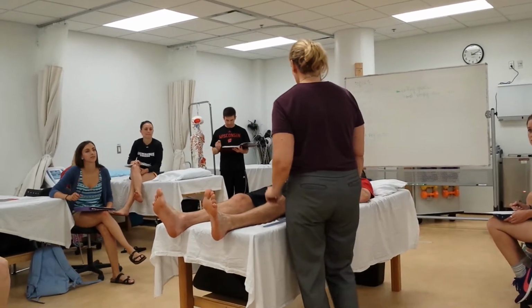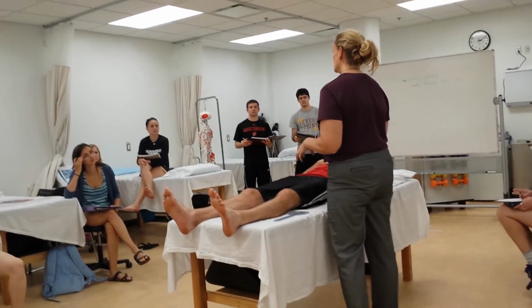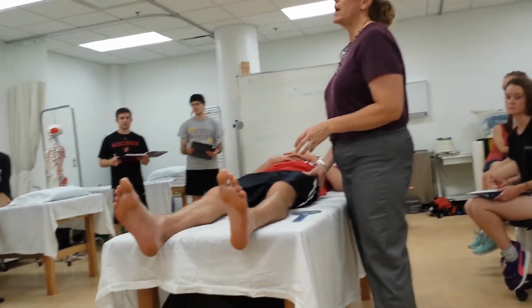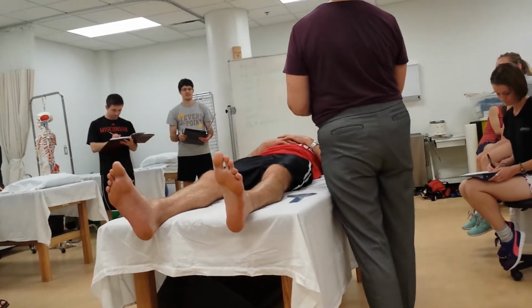So the other thing that you need to consider when you're working with the hip is what the pelvis is doing. So we don't want the pelvis to be moving when we're measuring hip motions. So it's really important when you're measuring hip flexion that you make sure that the pelvis isn't moving and that you stop the movement at the hip as soon as you feel the pelvis start to go.